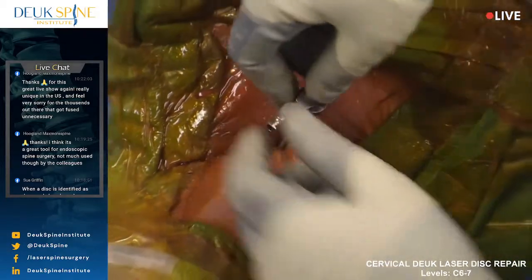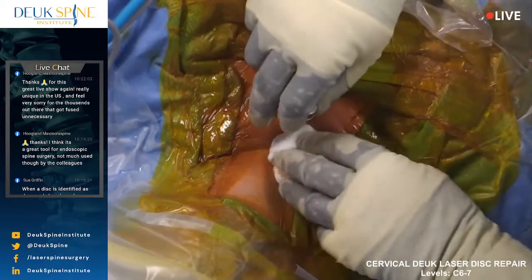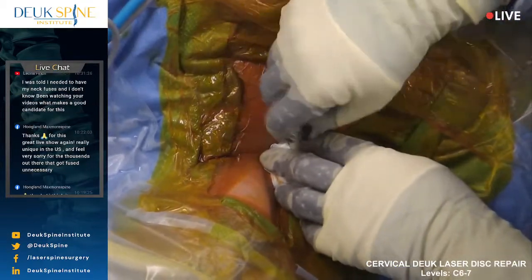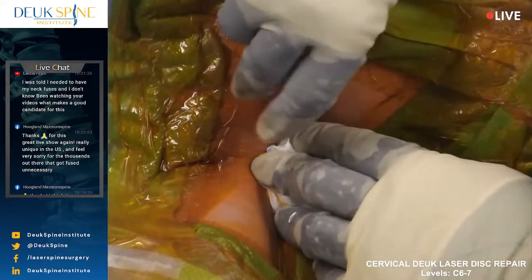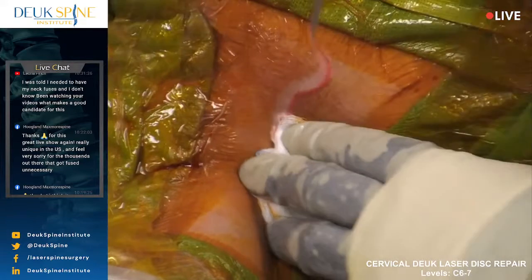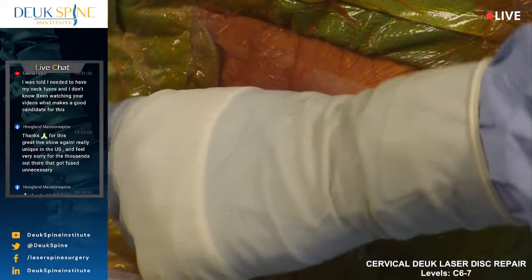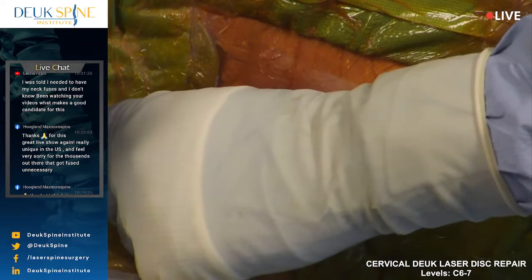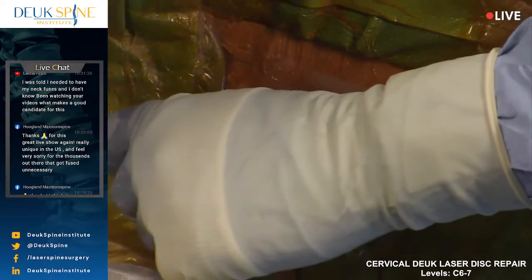And then I'm going to take this tube out. Okay? And then we're going to put some pressure. And we're done. I will show you the incision. It's just 4 millimeters wide. It's tiny. This is an amazing system that Wolf has developed for these surgeries. Wolf is the German company that makes the scope. And that's the system that I use.